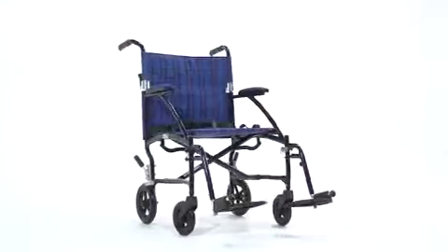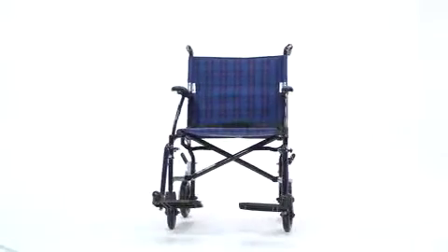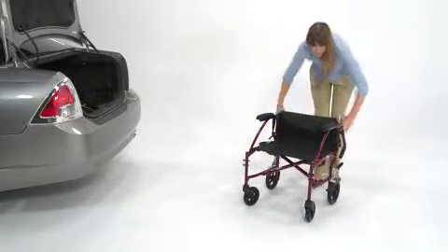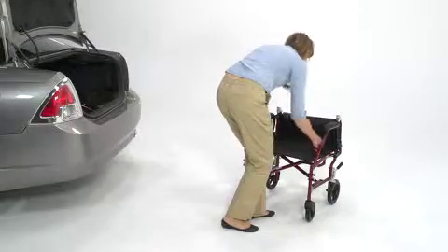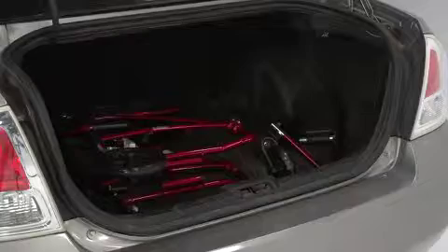Weighing only 14 and a half pounds, this ultra-lightweight chair folds down, making it easier to store and transport. Simply pull the locks up simultaneously and carefully fold down the back support. Then pull up the side seat straps. The contoured handles allow the chair to fold flat and compactly.